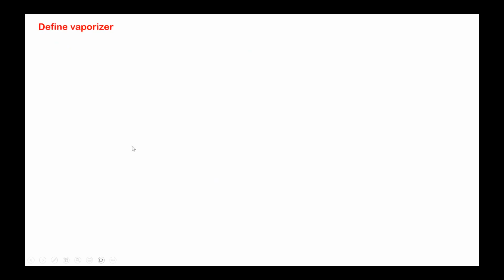Now, what is a vaporizer? Define a vaporizer. Why should you use a vaporizer? It's a device that changes liquid state to gaseous vapor state. Very good. And does it deliver a precise concentration? No, sir, we should adjust. No. Nowadays, you are using 1%, 2%, 3%. Yes, sir. Every vaporizer has those numbers. What is that purpose for? To deliver the correct amount of gas.